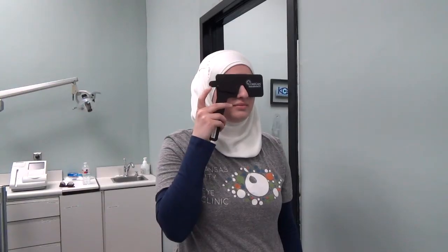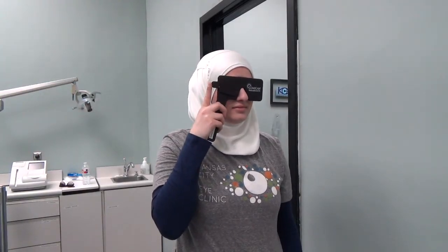You will then test the vision with the pinholes. Here you can see the pinholes on the occluder. You can drop these down and instruct the patient to find one hole and look through that hole only. The purpose of the pinhole is to limit the amount of light entering the eye. This should improve the patient's vision if they have a refractive error.